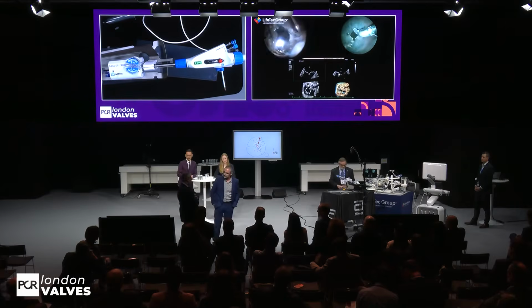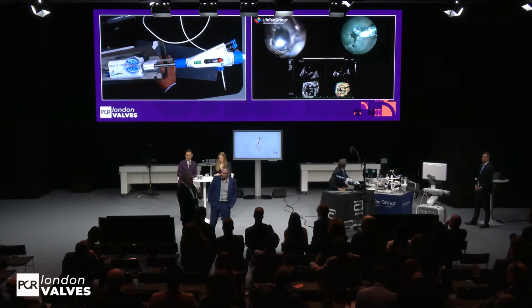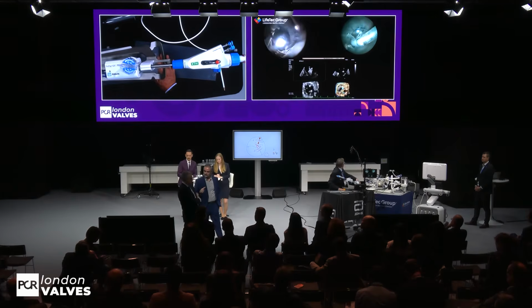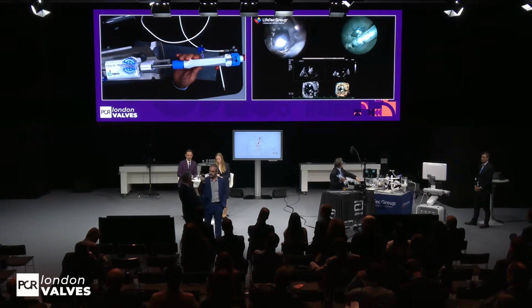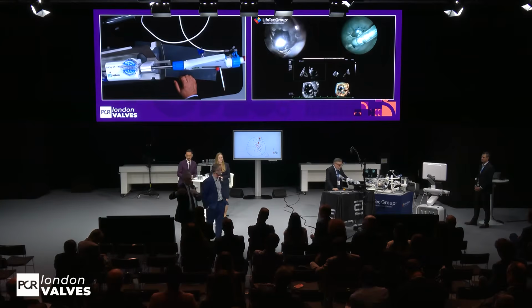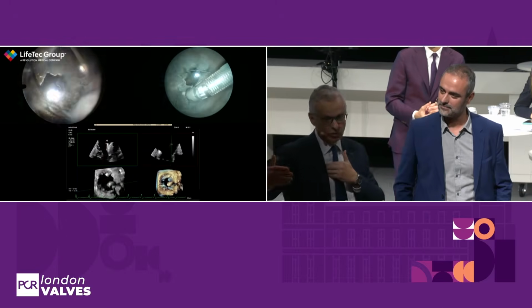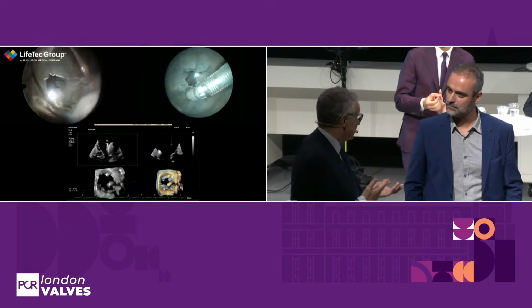So it's anteroseptal more. I would start anteroseptal anyhow, because I am sure that this is only associated. First of all, second, if you start posteroseptal, you will have shadowing, which will be a problem for any other clip. So when you do multiple implants, you always start with the most anterior one to avoid shadowing in a transgastric view. So you need to start anteroseptal first.